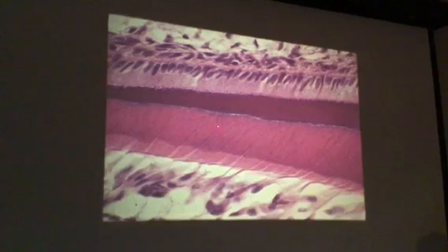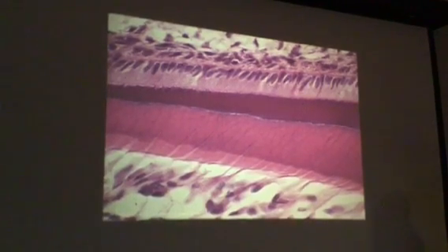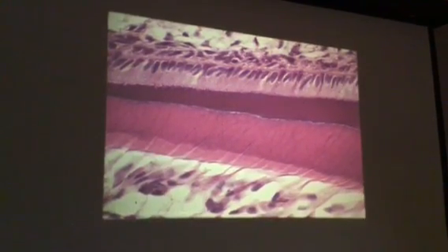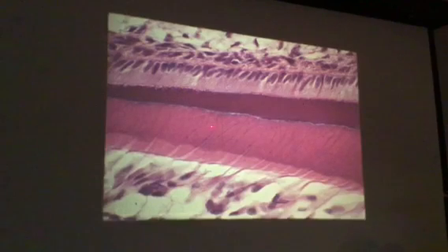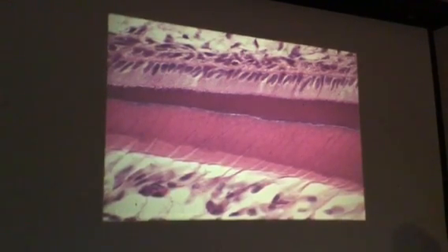Well, you could say it's an odontoblastic process, but it's best to be as specific as you can. So you would write something down like a dentinal tubule with an odontoblastic process, if indeed you could see that. So you have dentinal tubules, there's the DEJ right there, there's the enamel, and those cells are in what stage? Formative.